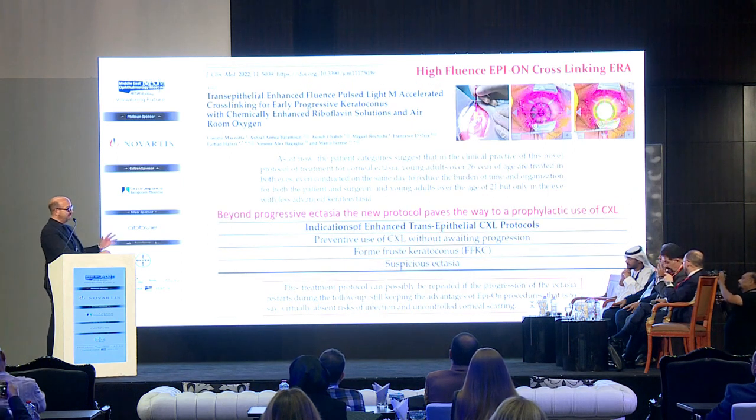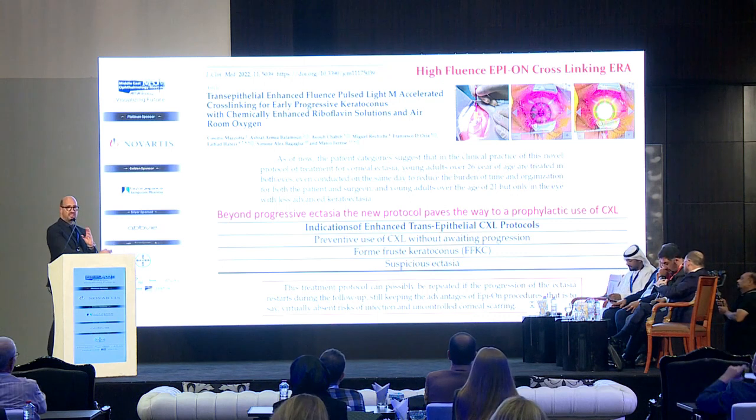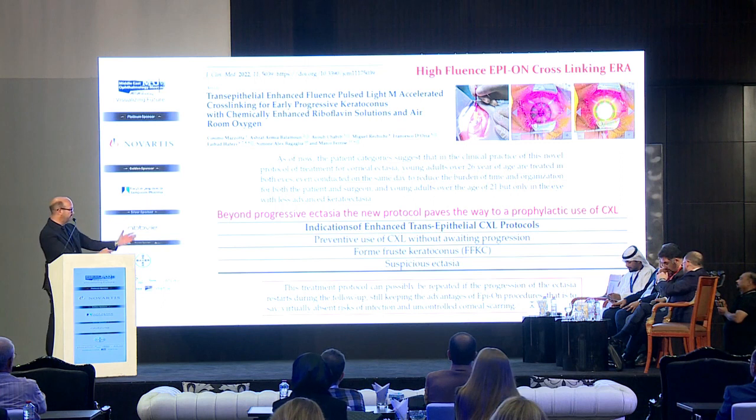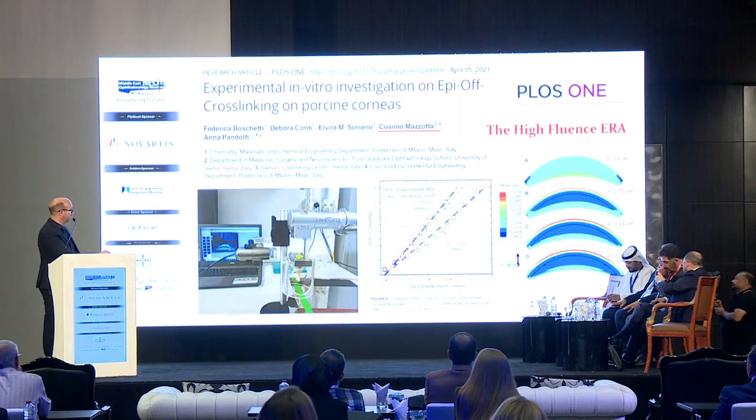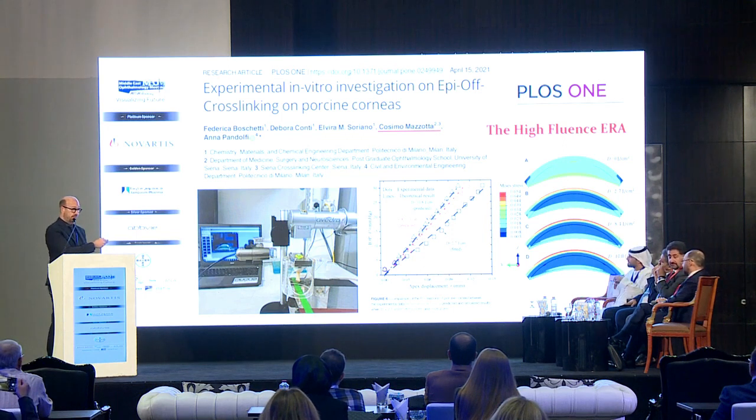So this treatment may achieve the goal also for a preventive use of cross-linking, also in forme fruste keratoconus, suspected ectasia, and in any case you want to do prophylaxis.